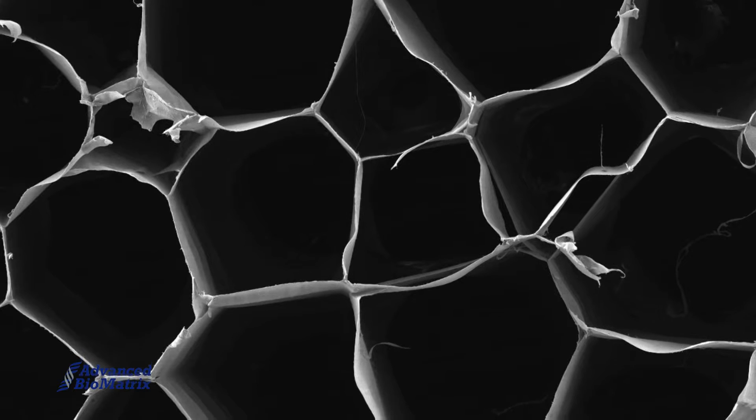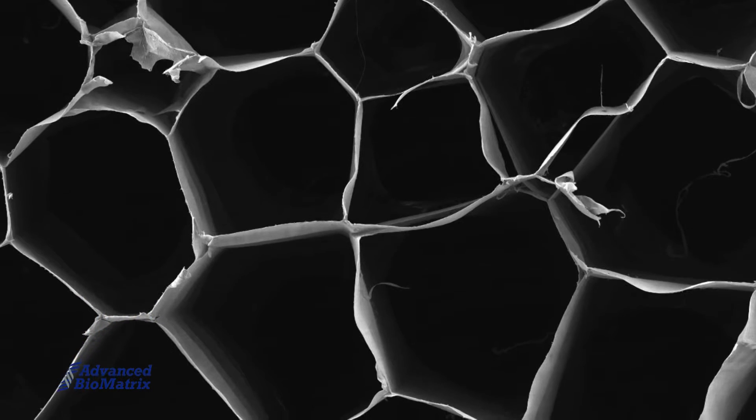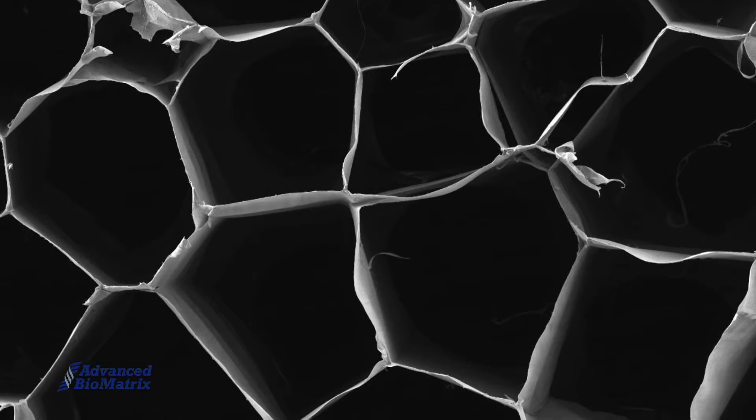This product has been used in multiple applications, such as tissue engineering and fabricating skin models. Here are the instructions for one such example.